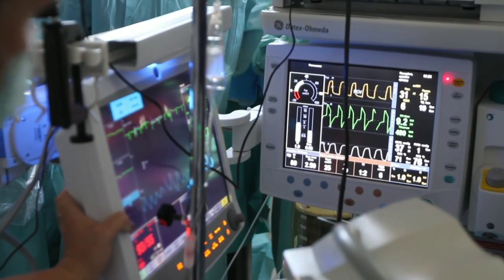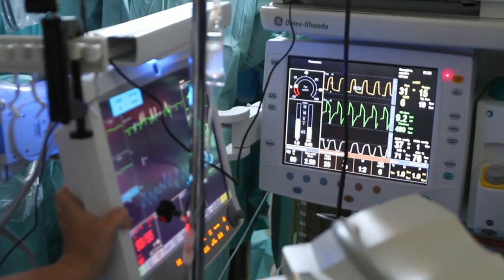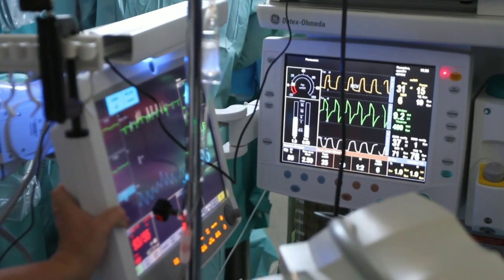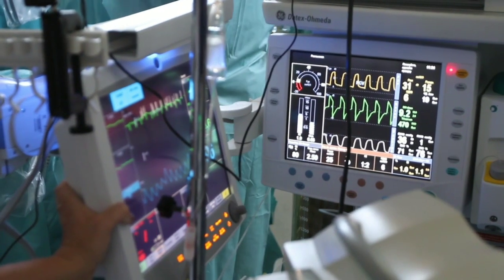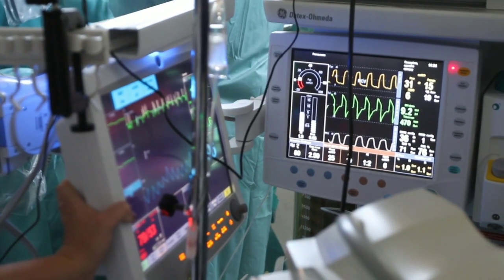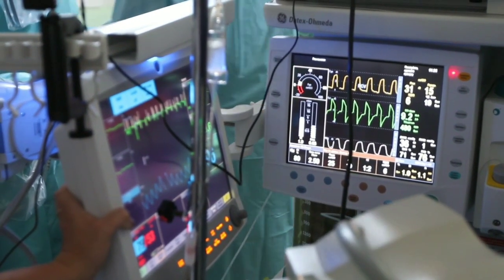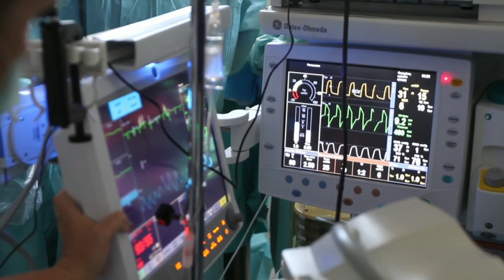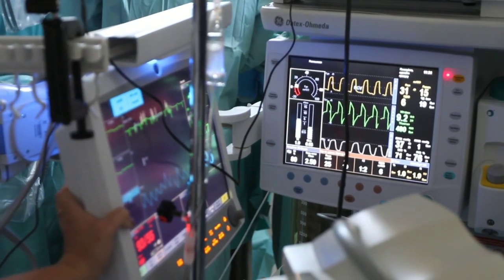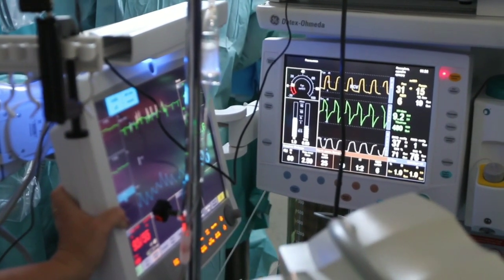After the electrodes are attached, the user selects automatic or manual lead switching, signal sensitivity, and frequency response range.